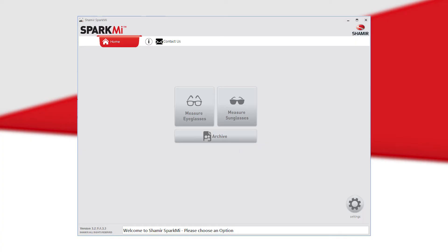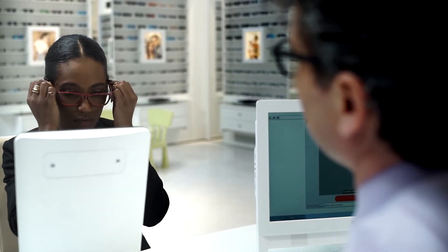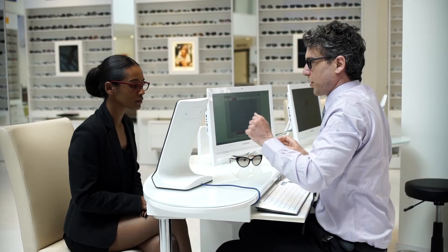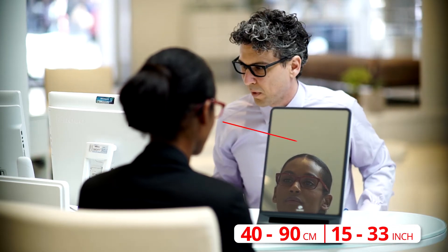Now you're ready to begin using your device and take your first SparkMi patient photo. For tinted lenses, select Measure Sunglasses; for clear lenses, select Measure Eyeglasses. Ensure that the frame is sitting comfortably and straight on the patient's face. The patient can either be sitting or standing, as long as the SparkMi device is 40 to 90 centimeters or 15 to 33 inches away from the patient's face.